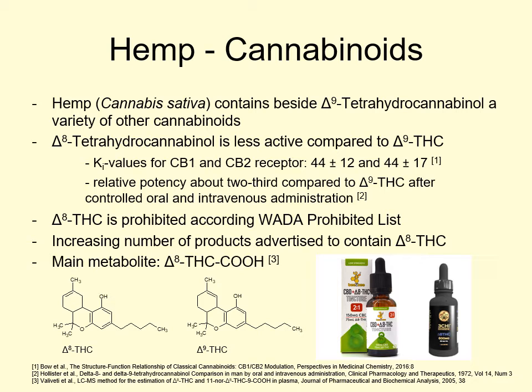Lately, more and more products advertised to contain delta-8 tetrahydrocannabinol occur on the market and in web shops. One reason for this increasing occurrence can be the unclear legal status in a variety of countries. According to the WADA Prohibited List, Δ8-THC is to be regarded as a prohibited substance under Section S8, Cannabinoids, Natural and Synthetic Tetrahydrocannabinols. In contrast to delta-9 THC, a regulation concerning a threshold concentration is not given for delta-8 THC.